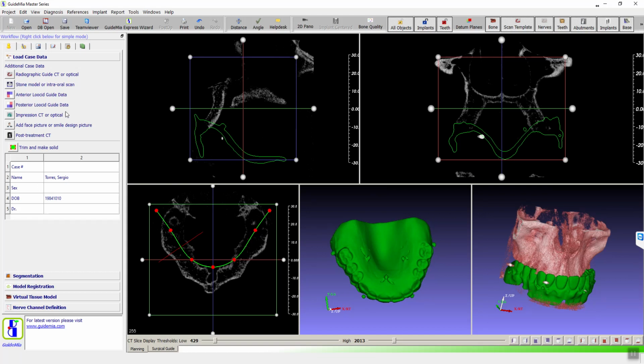Yeah, but I'm just saying for the future. For example, if you take off this one, everybody expects, all the different vendors ask for them to be on different planes and unevenly spaced. You just happened to nail it, and I didn't even notice. I've never had that issue, and maybe I've never really paid attention. You just happened to nail it. Super perfect. That's okay.